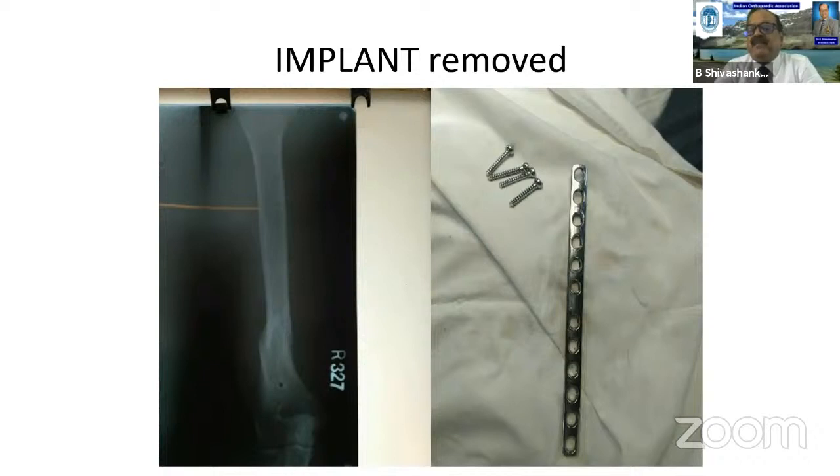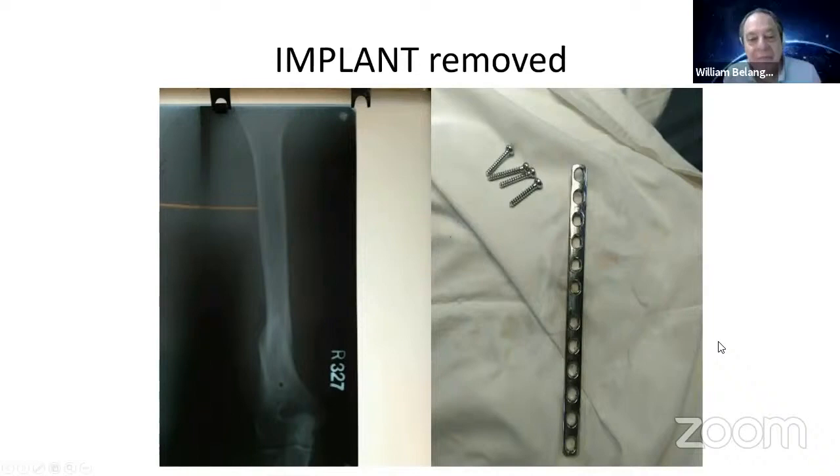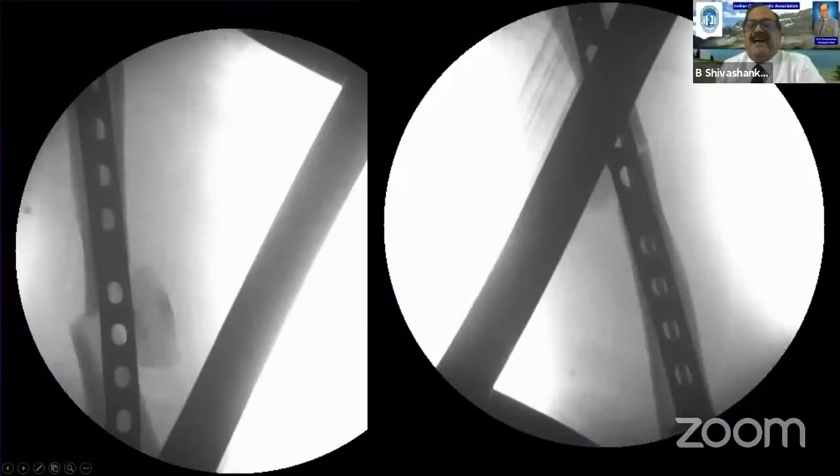And I have one more reason, my own reason. These are all locally made implants, and the total cost of this plate and screws is not more than about $30 US. I work in a private setup, and cost is a main constraint for my patients because they have to pay from their pocket. All of you are working in public hospitals where you don't deal with this part. So I have to deal with the economy of the patient also. That is another reason why I remove all these implants.